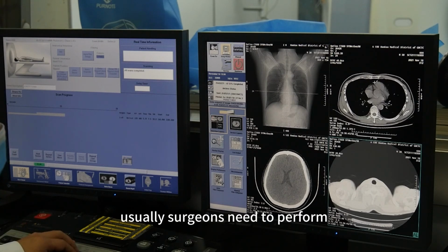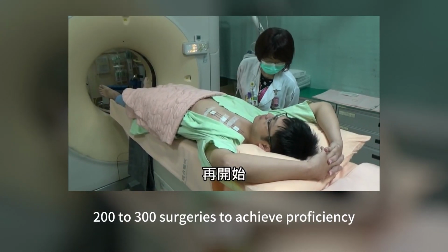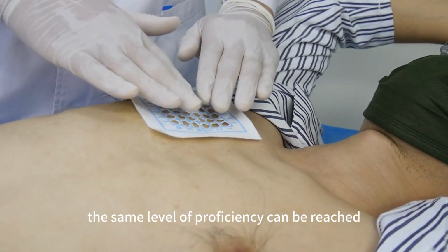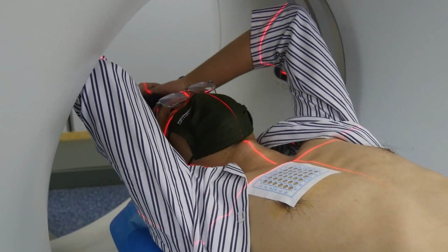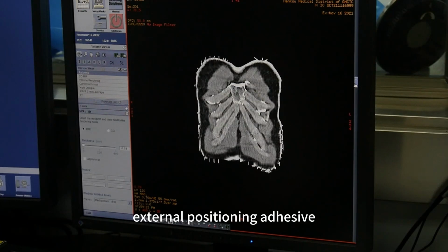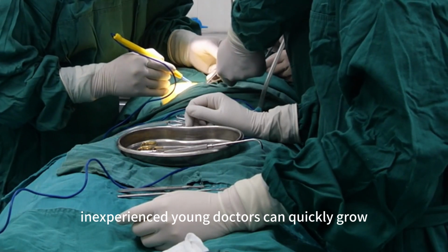Usually, surgeons need to perform 200 to 300 surgeries to achieve proficiency, but with the use of medical image-based external positioning adhesive, the same level of proficiency can be reached after 8 to 9 surgeries. By using medical image-based external positioning adhesive, inexperienced young doctors can quickly grow.